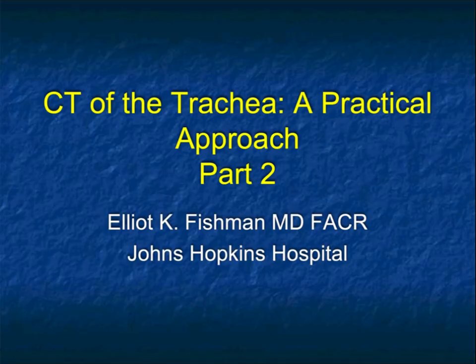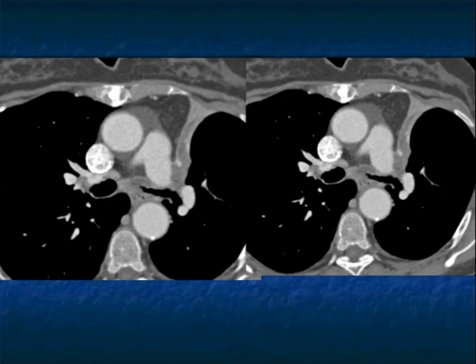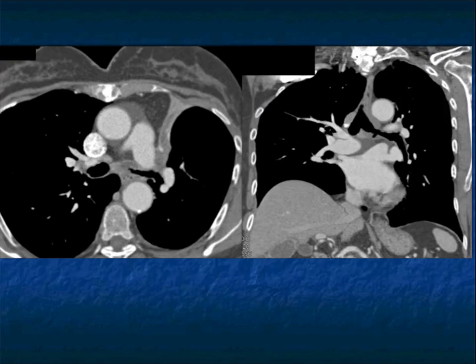Hi, this is Elliot Fishman and welcome to our latest talk on CT of the trachea. This is part two. I showed you this slide as I finished up part one — look at the trachea, look at the left main stem bronchus. The left main stem bronchus is diffusely thickened and narrowed, and then there's collapse in the left upper lobe. Here is another look at it. So now you have an infiltrating process.